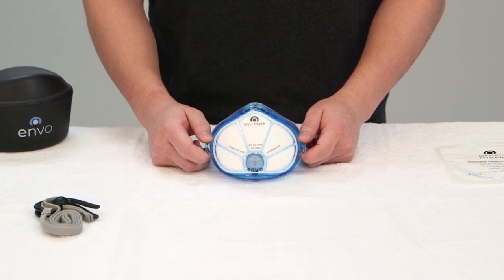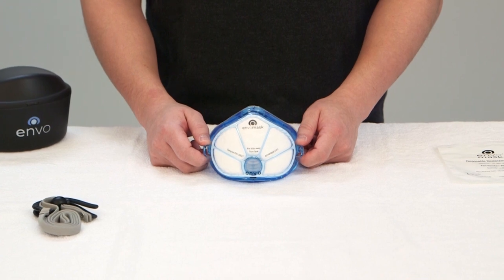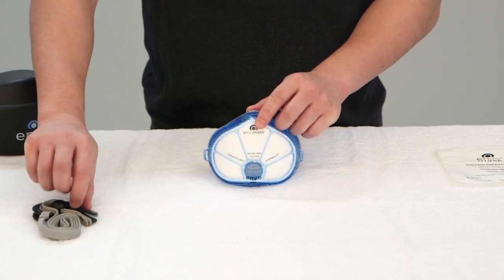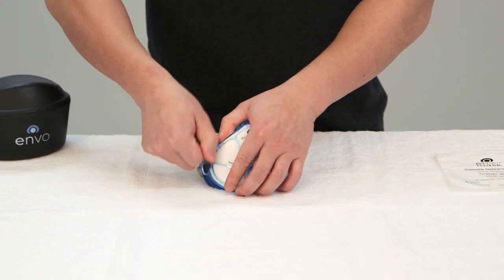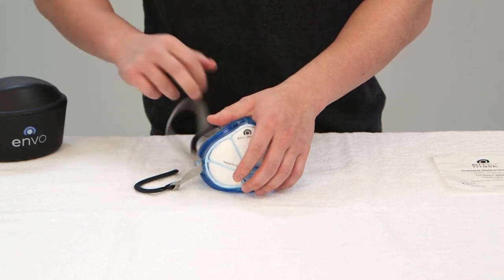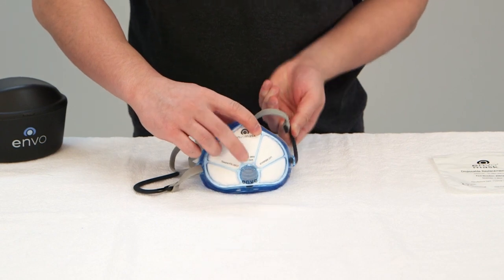Remove the quick-fit headgear from the packaging and place the respirator mask vertically on a flat surface with the exhalation port on the bottom. Position the mask so the air gel cushion is facing you and gently slide the ear clip through the headgear slot release tab of the filter cover. Then pull the ear clip completely through. After one side is complete, repeat this step on the other side.